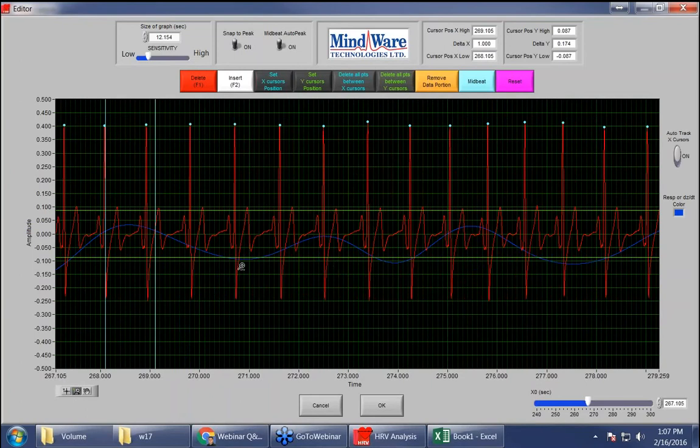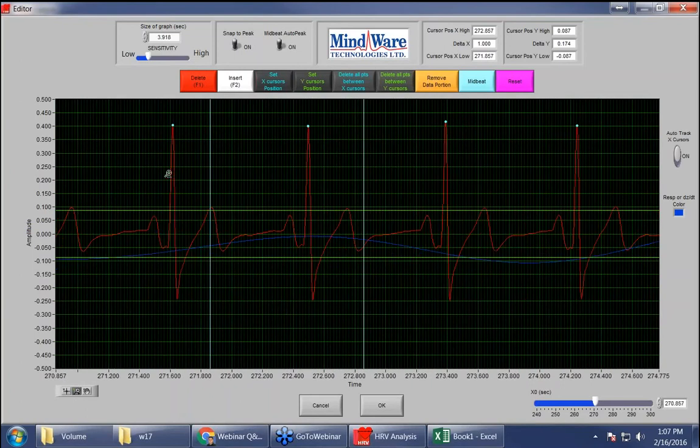If you can see it, those are picture perfect QRS complexes, or P wave or T wave after that. Then let's say that the algorithm accidentally put one here and not here. Deleting this and putting this in would not be considered part of the 10% rule. It would only be if you had to artificially put it in there, or you're having to estimate where the R peak would be. And then as far as deleting the chunks, all you really need is that minimum of 30 seconds of continuous data. So the 10% rule would not apply to that.